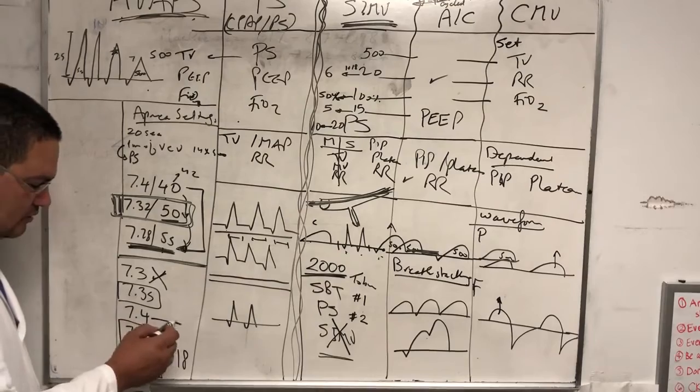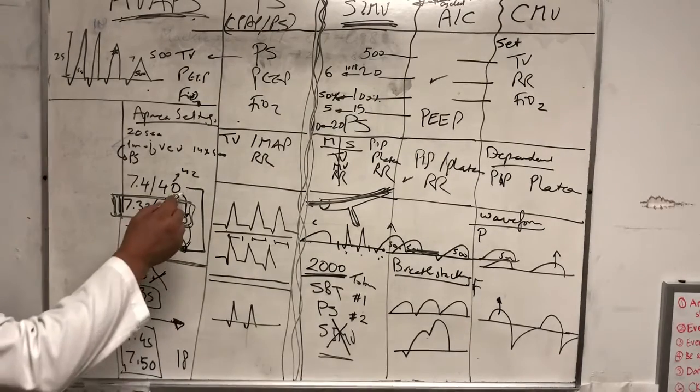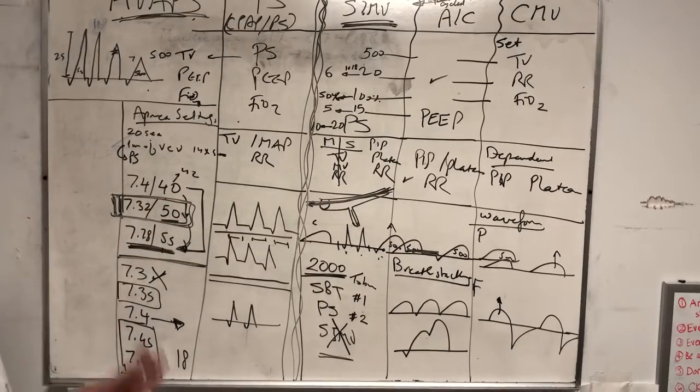And then this one is not bad. The 7.4 is not bad, but of course you have to think about it in these terms. The patient has to go through every SBT, and we'll wait for a long time for him to breathe. So it'll not be practical. And also, I want the patient to be on their toes all the time, always breathing above the vent. If he's 7.4, he might not breathe above the vent, right? So we always have to maintain 7.35. And that is it.